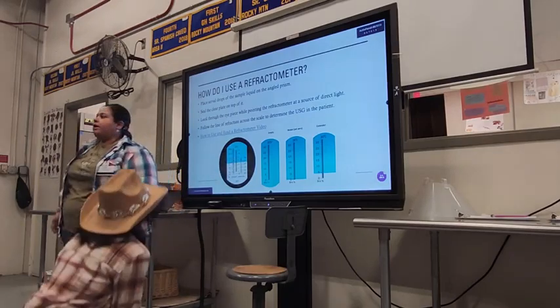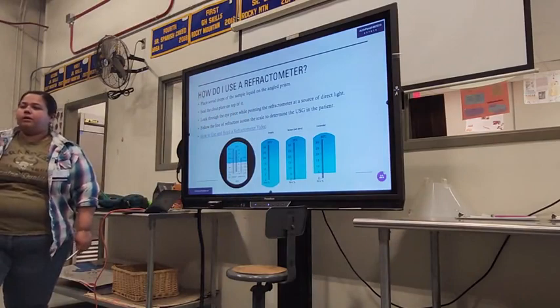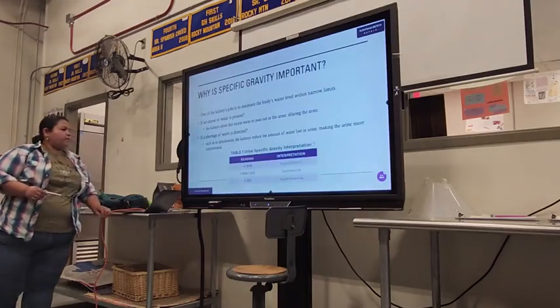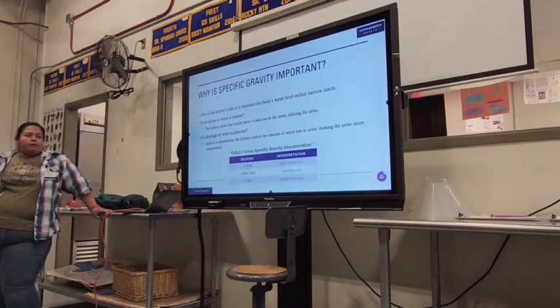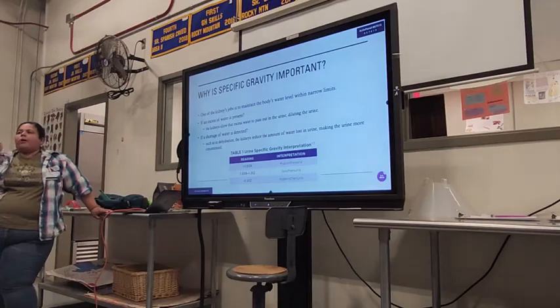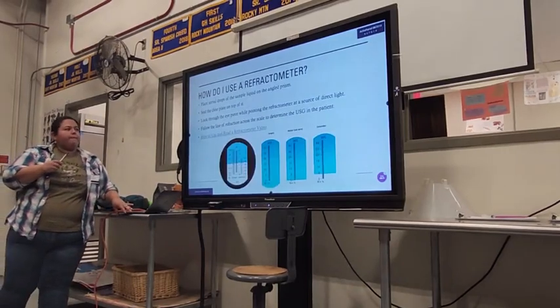Looking at our chart from the slide beforehand, where does 1.036 fall? The first one. Greater than hyper. It would be hyper. The terms in that interpretation portion, you all are going to have to define. Okay, just so you know.